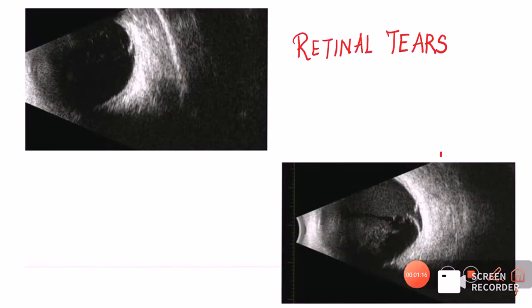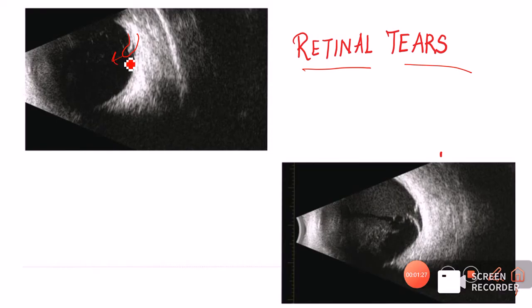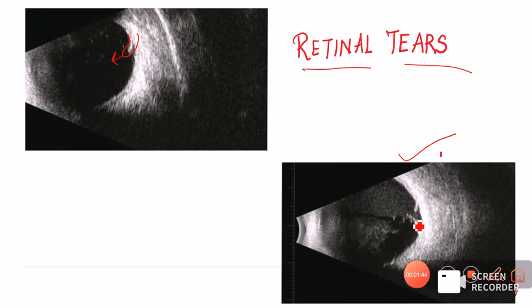Now let us see a few B-scan images of retinal tears. In the first image, there is a discontinuity in the retinal surface and the retina seems to be pulled a little bit forward — this is one case of retinal tear. In the second picture, we are also seeing diffuse vitreous opacities present in the vitreous gel. This is nothing but an acute retinal tear that has bled into the vitreous cavity — a vitreous hemorrhage.